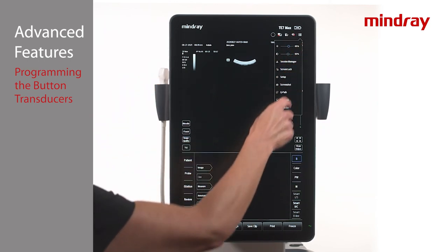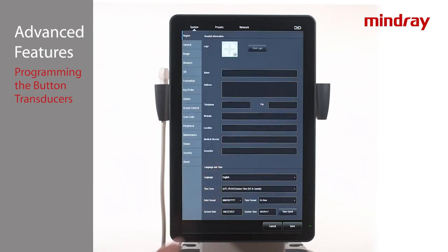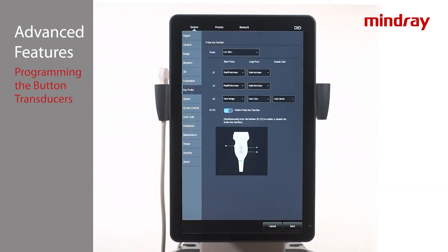To program the L12-RC transducer, tap the menu icon in the upper right-hand corner of the screen. Tap Setup, then along the left, select the tab labeled Probe. Note that on some software versions this may be called POC Probe. This brings up an illustration of the transducer and applicable button keys. Use the drop-down arrow next to each button to select the desired function. There is the ability to program a short press, a long press, and on K3 a double-click as well. Make desired selections and tap Save at the bottom of the screen.